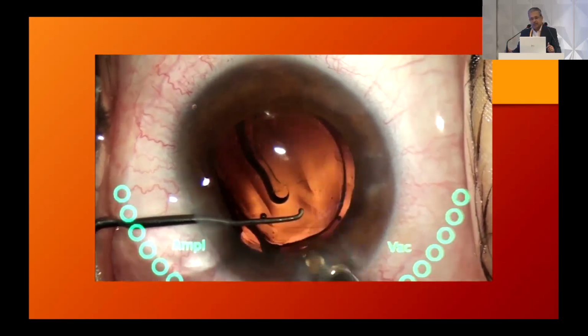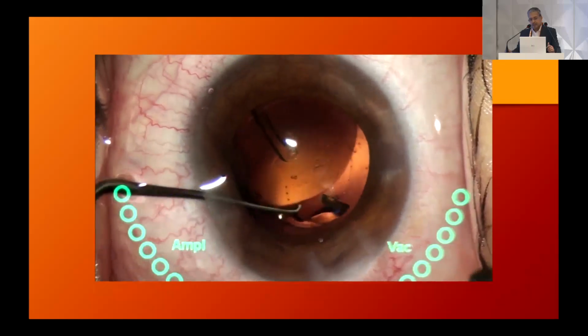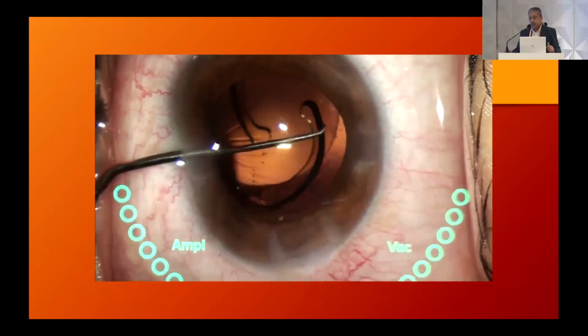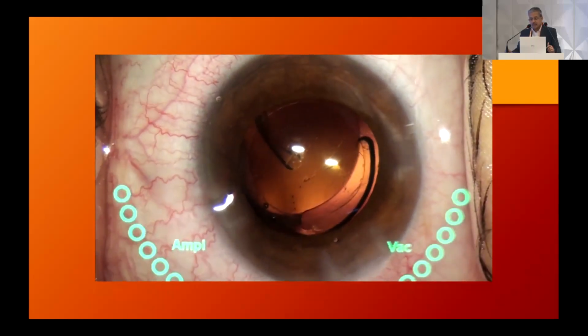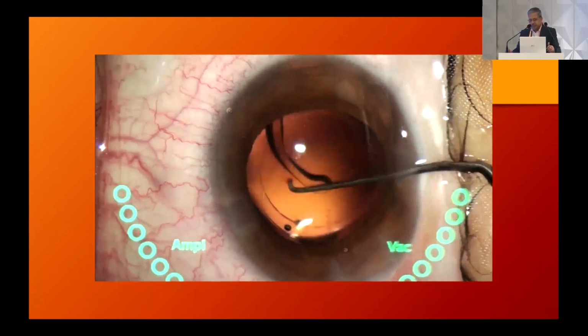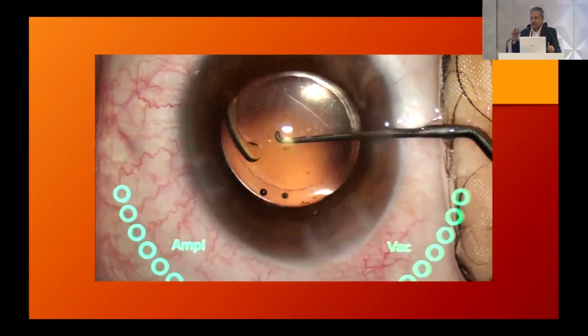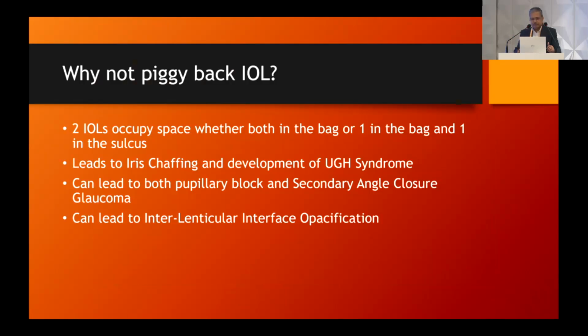Now you inject the monofocal toric, and it was, as you saw, a toric, and you put a toric back again. And lo and behold, the patient's vision was 6/6 unaided. There was no induced astigmatism. It's very simple. All you have to do is basically make sure that you free the IOL from all sides.